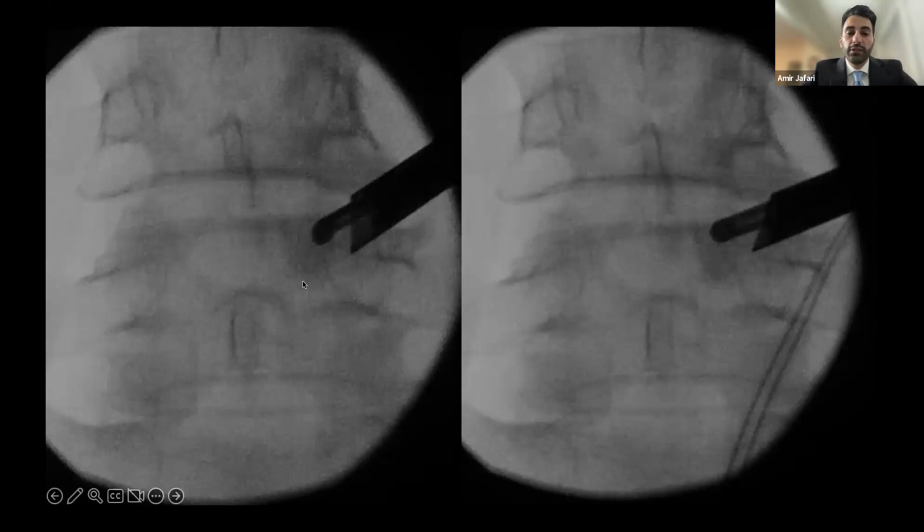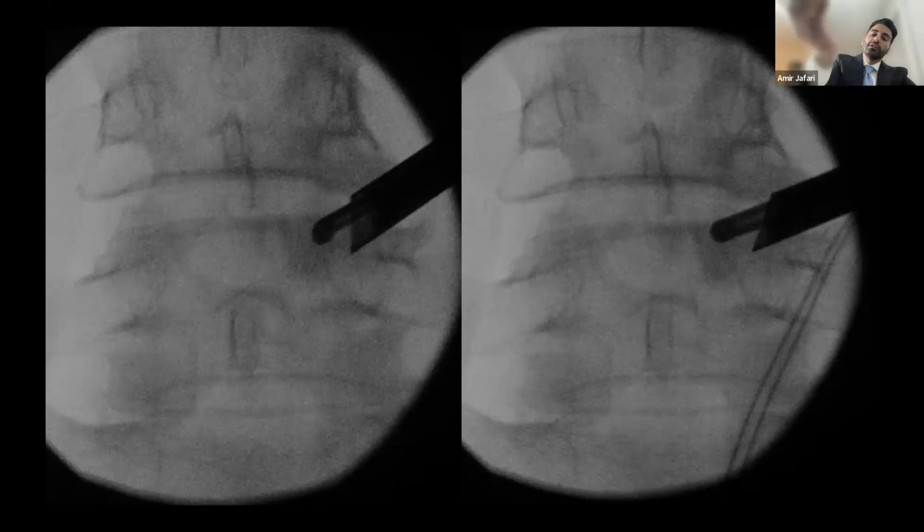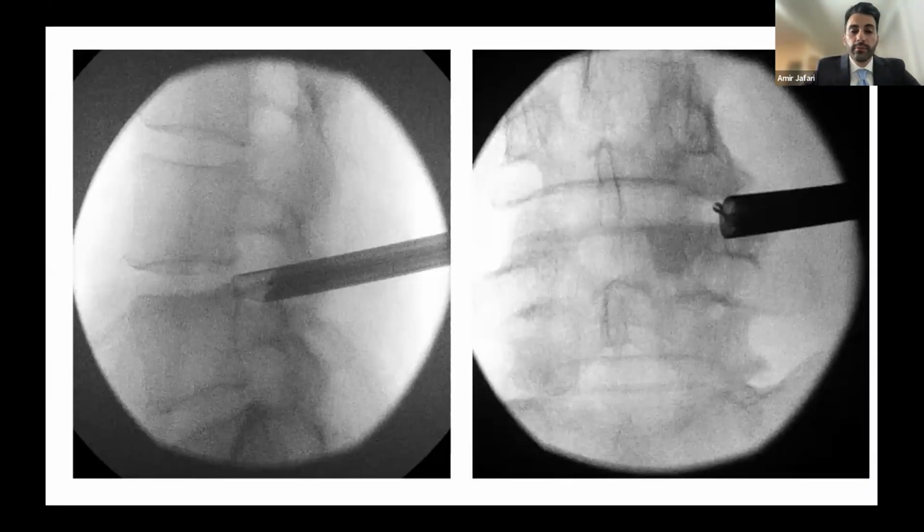Now that I've worked my way medial, remember when I said the lateral recess L5 traversing nerve is also my concern. I want to future-proof it. Well, the Kerrison is used to take out the SAP and the IAP from inside out. So I have found the epidural space, and now I am putting my Kerrison, which looks like an L, underneath the SAP and scraping bone off, trying to free up the lateral recess, pulling some ligamentum flavum from inside out.